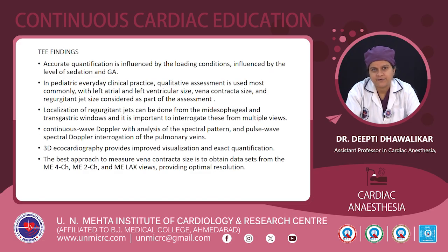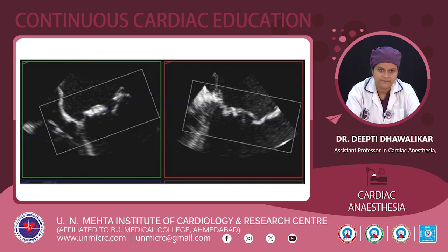TE findings. Accurate quantification is influenced by loading conditions and by the level of sedation in GA. In pediatric everyday clinical practice, qualitative assessment is used most commonly, with the left atrial and ventricular size, vena contracta, and regurgitant jet size considered as important parts of assessment. Localization of regurgitant jets can be done from the midesophageal and transgastric views, and it is important to interrogate these from multiple views. Continuous wave Doppler with analysis of spectral pattern and density, and pulse wave spectral Doppler interrogation of the pulmonary veins are also important. 3D echocardiography provides improved visualization and exact quantification.